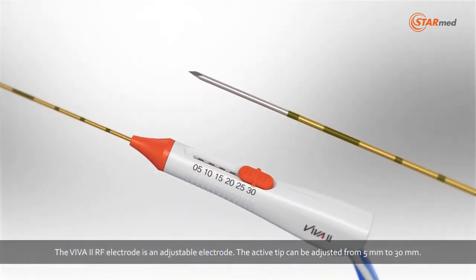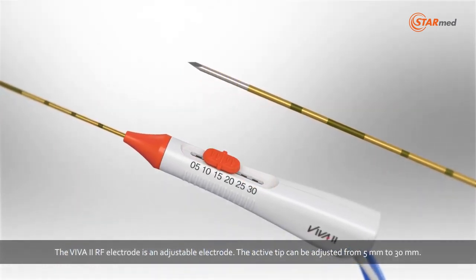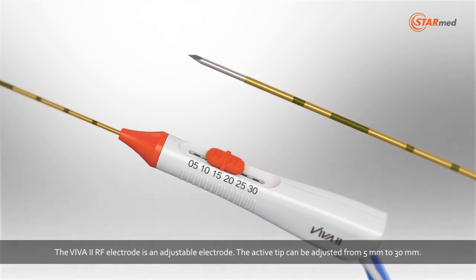The Viva 2 RF electrode is an adjustable electrode. The active tip can be adjusted from 5 mm to 30 mm.